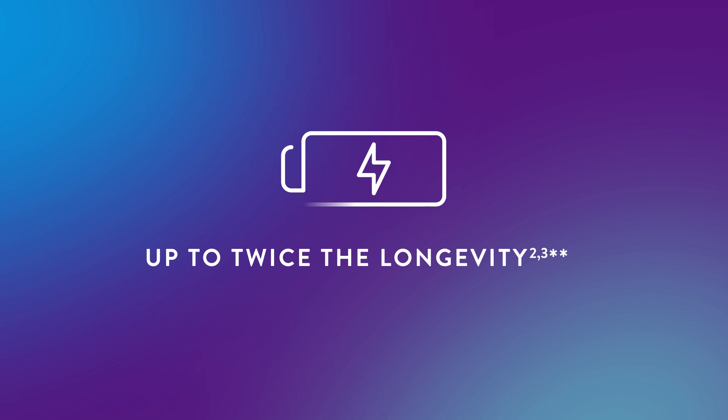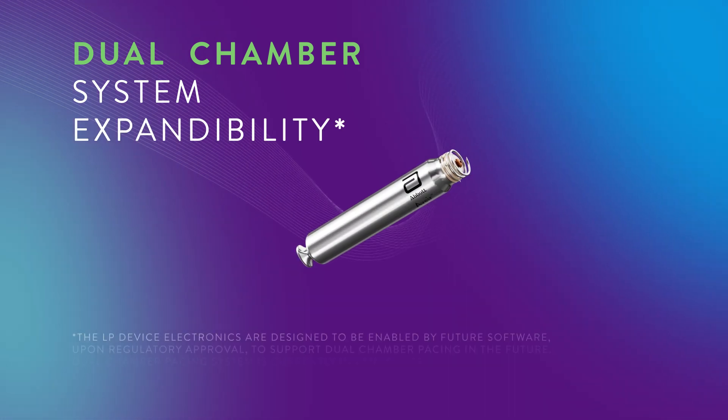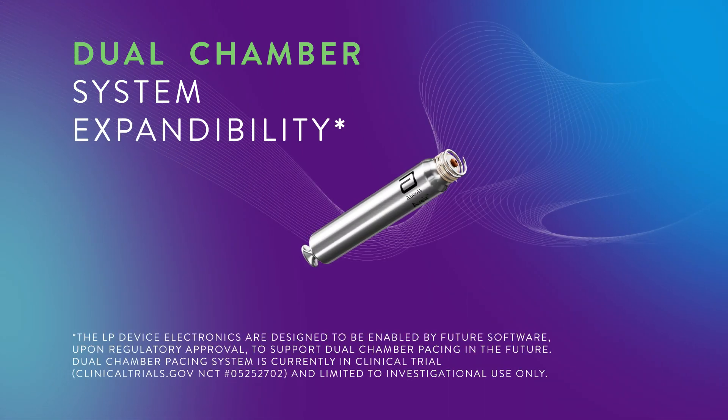The Avere VR Leadless Pacemaker provides up to twice the longevity of the competitive leadless pacemaker at ISO standard settings. It is also designed to be expandable to a dual chamber pacemaker system upon regulatory approval.